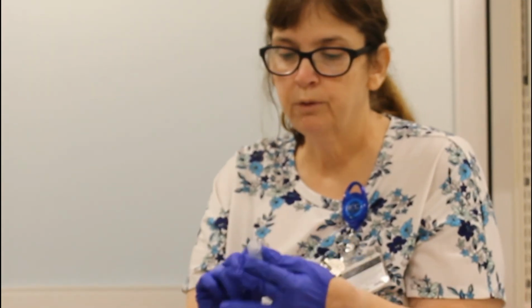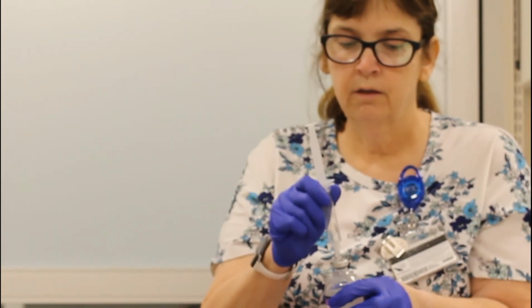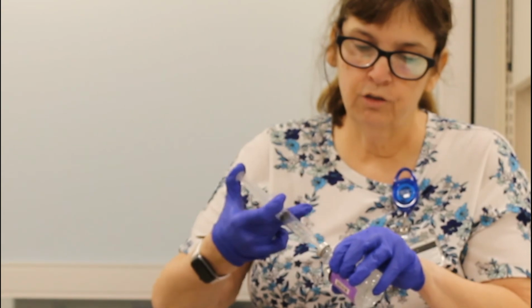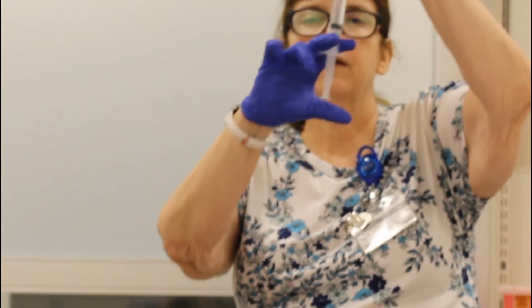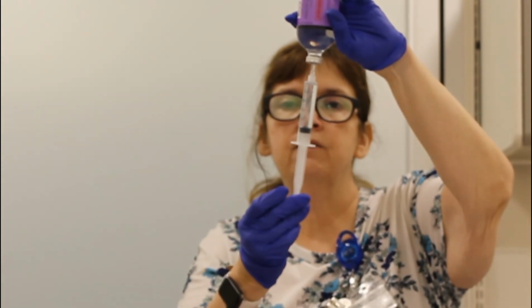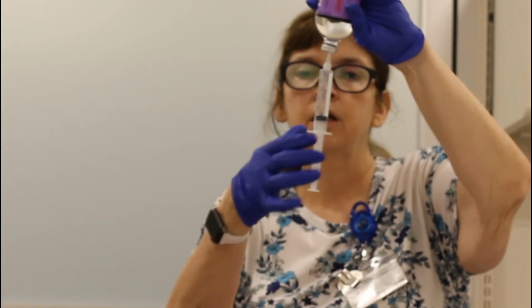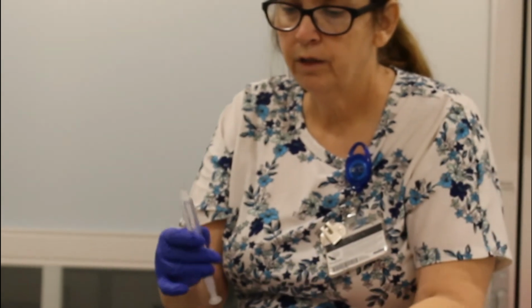Remember, when you're drawing from a vial, you always want to inject air first. So you're going to inject 10 mLs of air, because that's how much I want to draw back, and then I'm going to draw out my 10 mLs. Also, when you're handling the syringe, you only want to handle the end of the plunger. You don't want your hands all over the inside of that. All right, so that is 10 mLs of calcium gluconate.